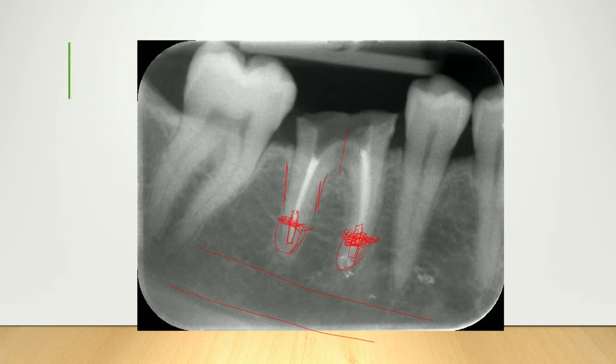I would try as much as I can to either use a small round straight burr or a straight burr to remove the remaining root canal structure. So it's really easy to see because it's orange coloured in the middle of your retained root. So just buzz it and then remove it, leave the retained root, and you'll just get bone growing all the way over again.